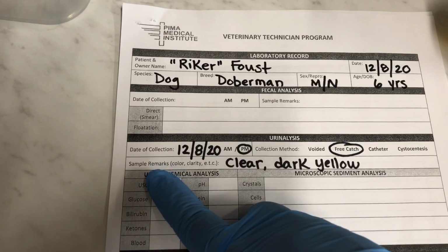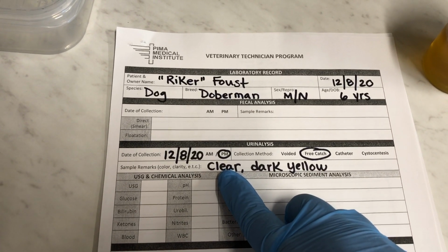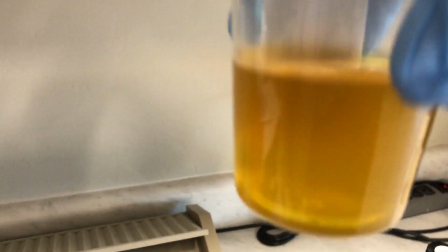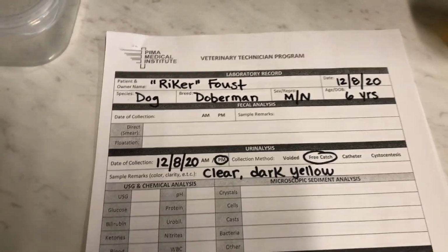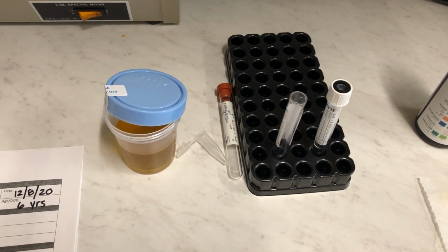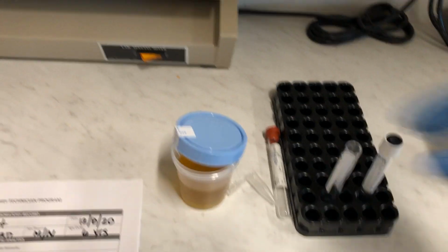And then for the sample remarks, you want to just put a mark about the clarity of the sample and the color. So this is his sample here. It is clear, you can see through it, and it is somewhat of a dark yellow. So that's what I've indicated on his form. Now I can begin, and I like to begin by setting up my sediment tube so that it can spin in the centrifuge. And while that's happening, I can run the rest of the urinalysis.